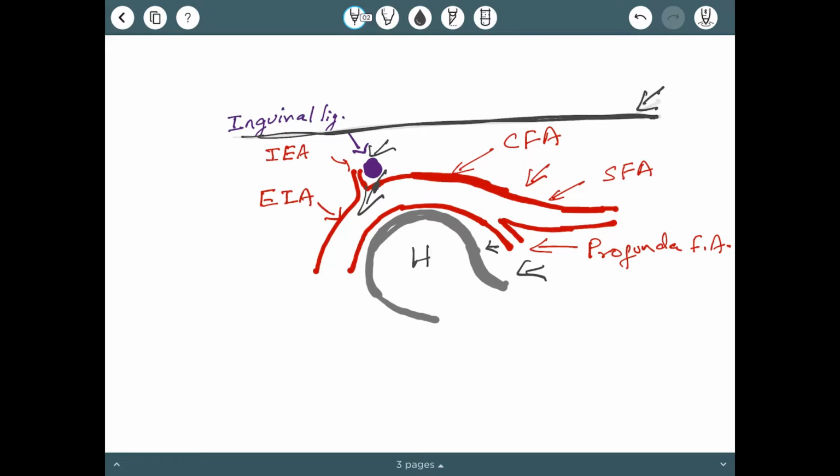You can puncture one of those arteries and damage it, you may not notice during the procedure, but that damaged artery will continue to bleed, and it can lead to a serious complication, which any interventionist is always wary of and prays never happens: retroperitoneal bleed, a very serious complication.